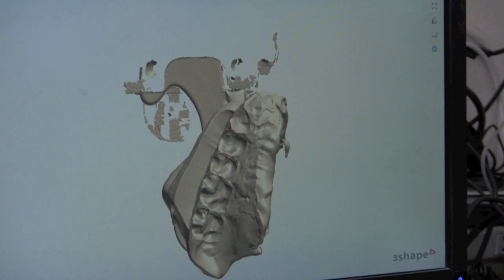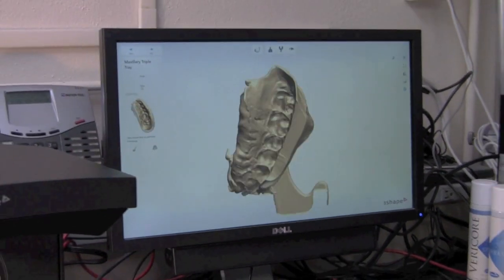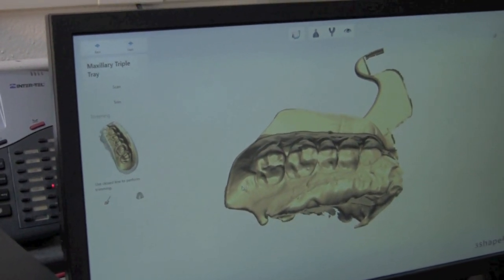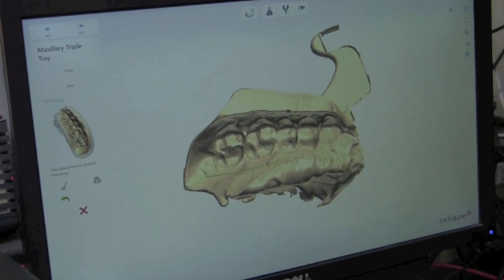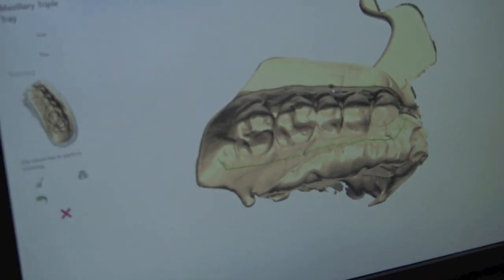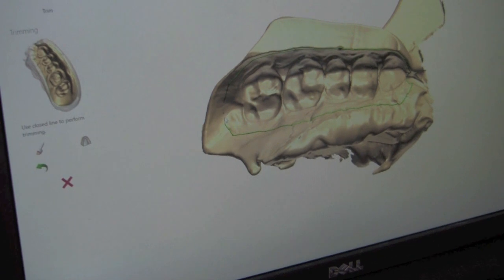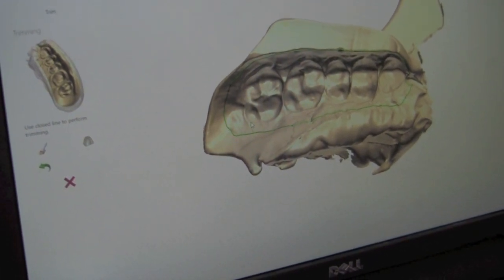Once the model finishes post-processing, we're going to select Trim up here at the top left. All we're going to do is move this around so we can see the entire impression, and we're just going to single click and trace out the area that we want to keep on the model. Always make sure that you're working in the same direction, and then when you get to the end, you'll want to single click on the first spot that you started on.